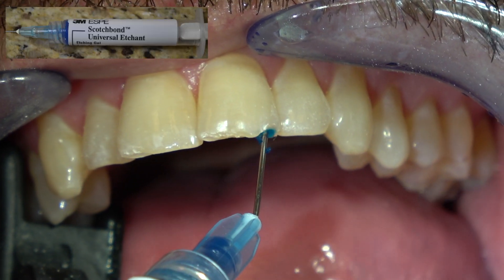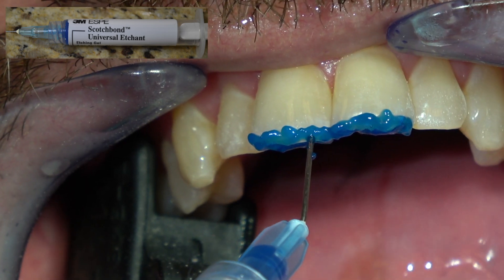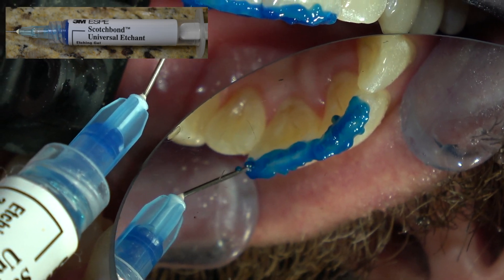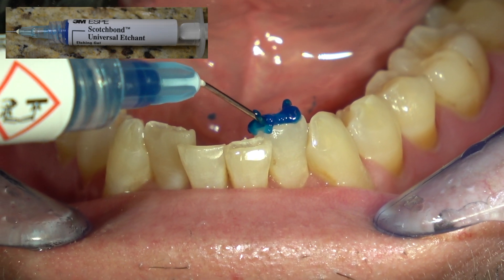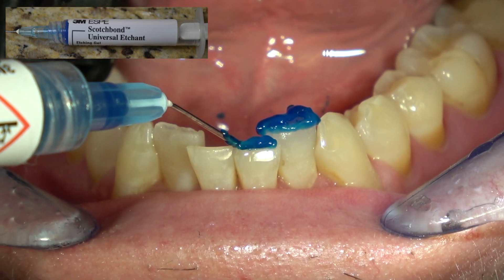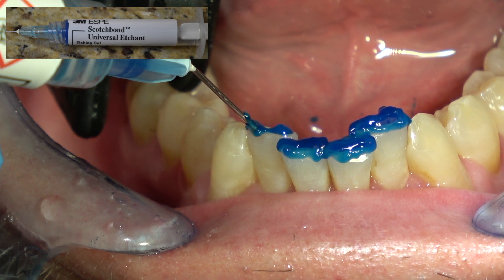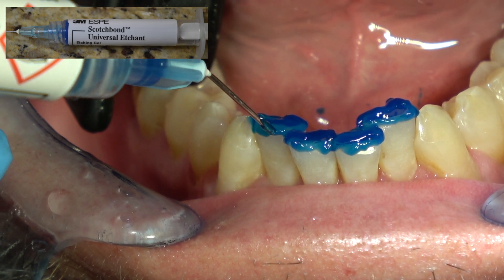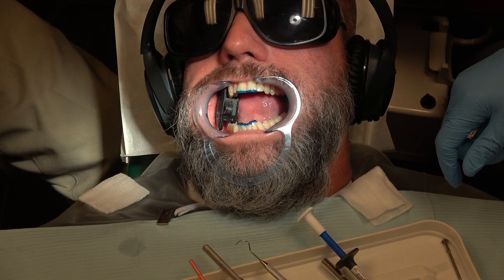This is 38% phosphoric acid we're using to etch the teeth, and I'll leave this on there for about 45 seconds. Take it off in the order of the teeth that you placed it on first — since I placed it on the maxillary centrals first, we'll remove that first. You can etch enamel pretty much as long as you want — I'll etch enamel normally 45 seconds to a minute. And dentin you don't etch as long — anywhere from 15 seconds to 45 seconds.